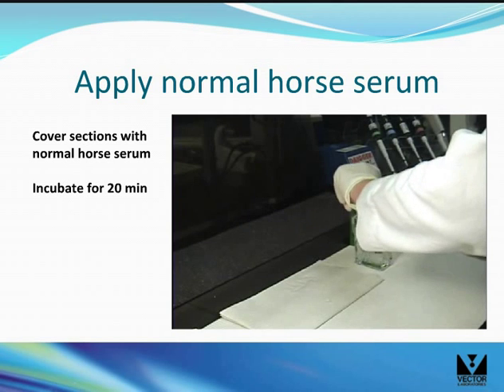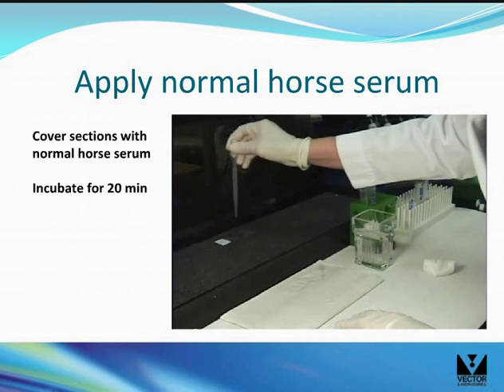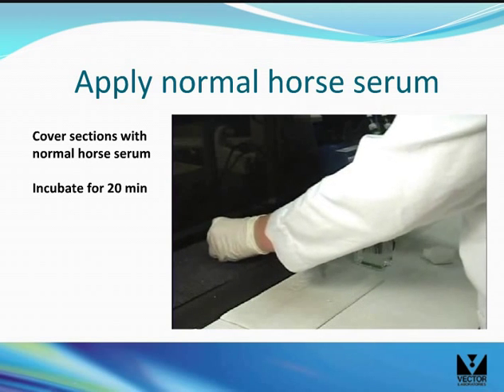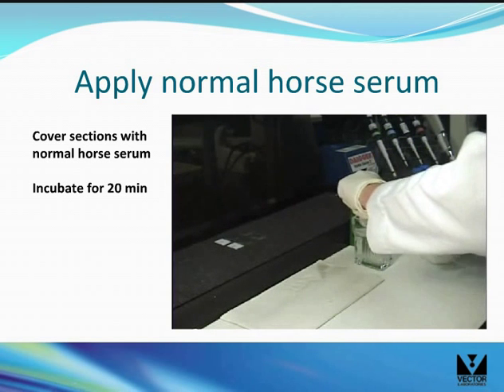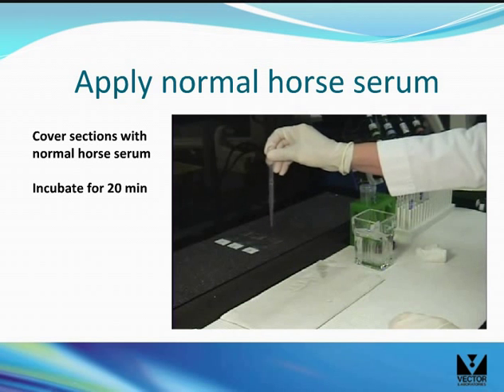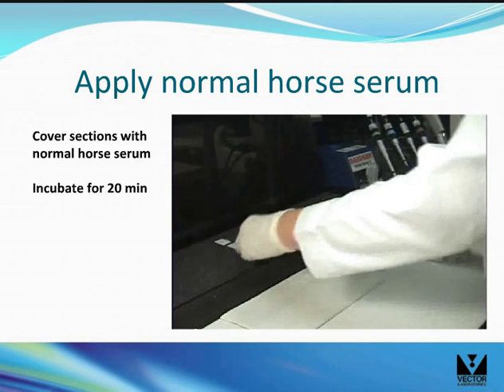Remove the slides from the buffer and briefly wipe the excess buffer with tissue as shown. Cover the sections with diluted normal horse serum — usually about 100 µL is required. The normal horse serum serves as a general protein block to minimize nonspecific interactions of subsequent detection reagents. Depending on your application and blocking requirements, a blocking solution dilution of between 1.5 and 10% normal horse serum would be reasonable. Incubate for 20 minutes in a moistened darkened chamber as shown.